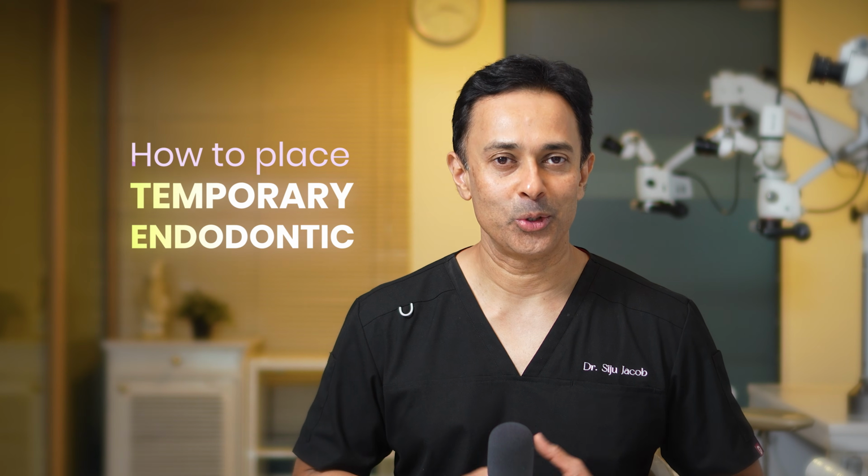Today, we're going to talk about how to place a temporary endodontic restoration. This is another one of those requests that you guys have asked for in the comments section. So you asked for it, so here it goes.